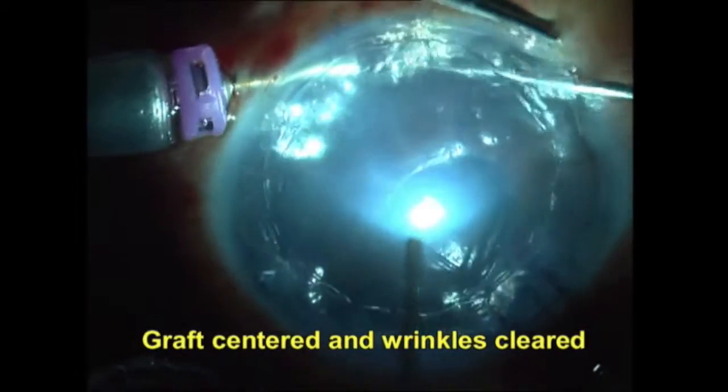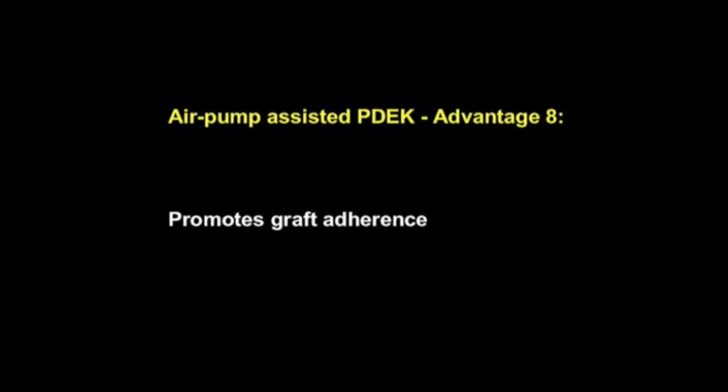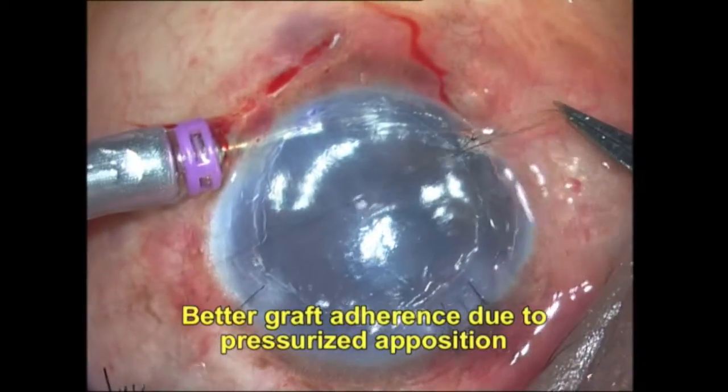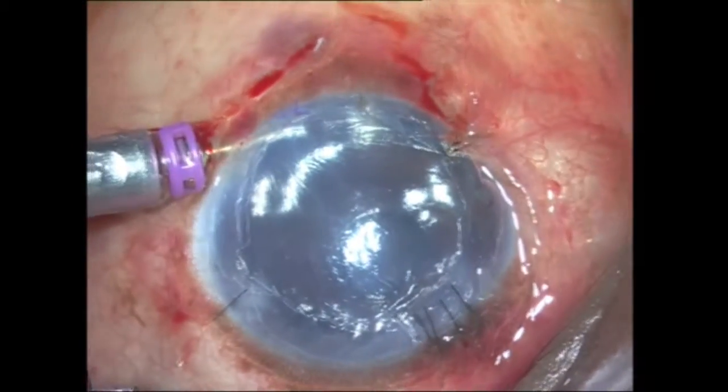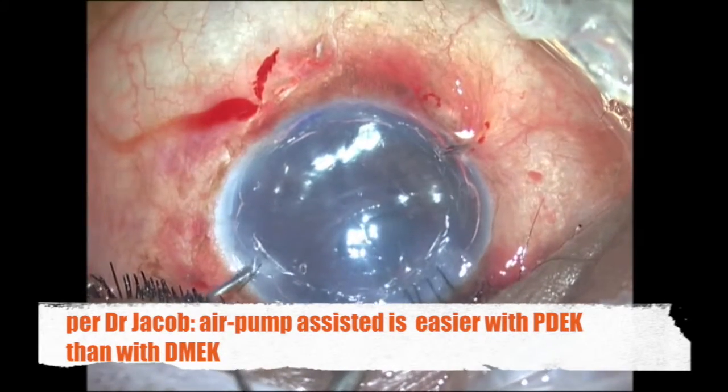Otherwise, every time I entered and exited the eye, the anterior chamber would have shallowed, the graft would have dropped down, and this would have been a mess. But the air continuously supports it. You can center the graft, you can unwrinkle the graft, you can have the air going till you're finishing your suturing, and that continuous air pressure, which is pushing the graft against the overlying stroma, helps to give you better adherence of the graft even post-operatively.